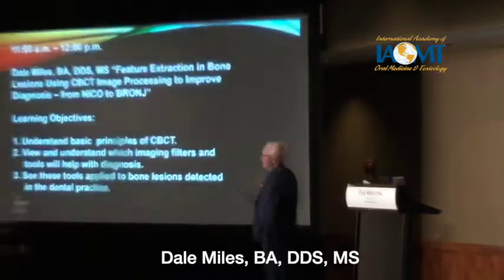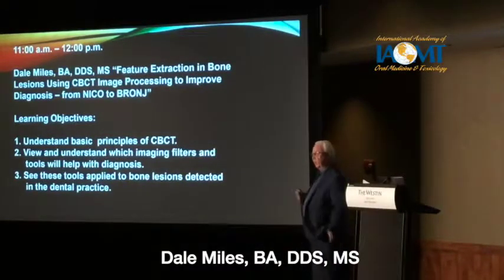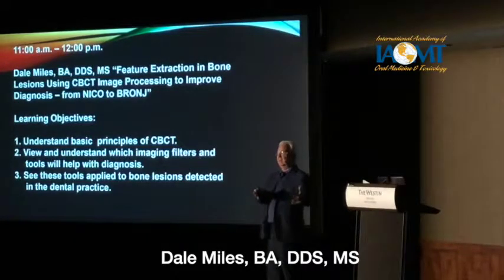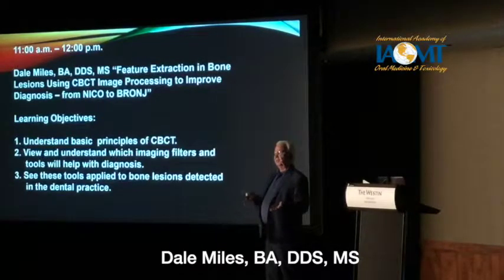Anyway, what I'm going to do in the back half is show you some images that are comparable to what you're getting in your offices, okay? I'm going to stick to cone beam. Some of you are adopting, some of you already own cone beam. Some of you, unfortunately, have machines that give you crappy images, okay? And I have to say it like that.